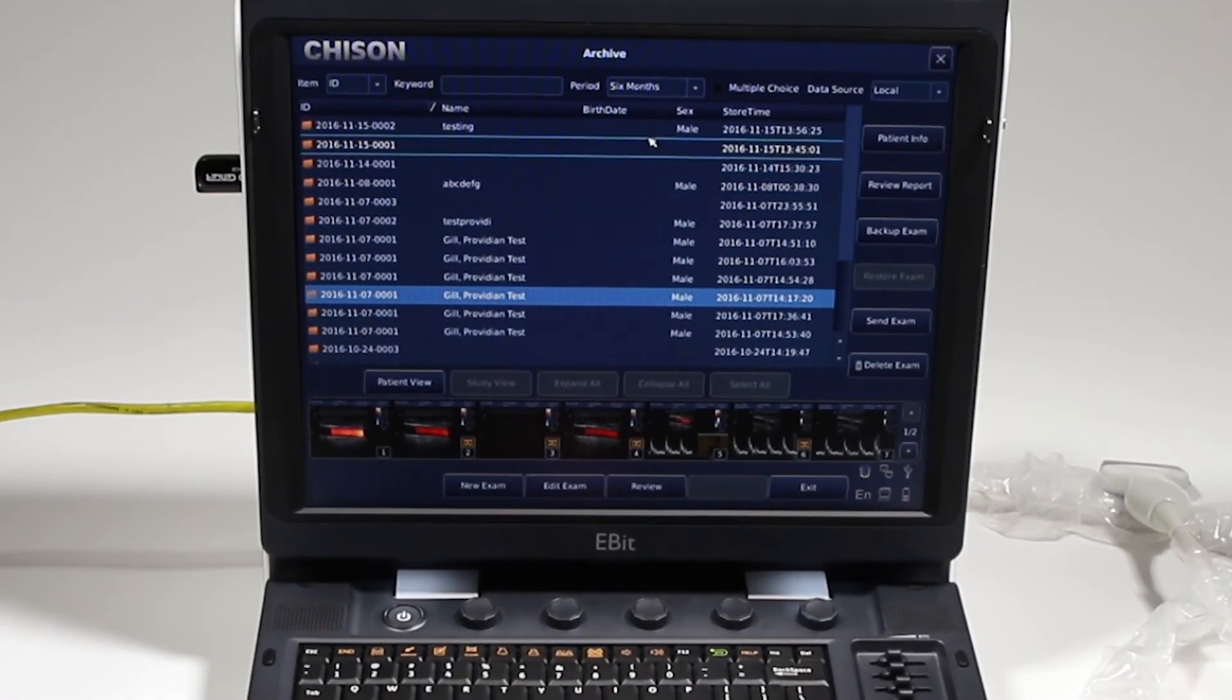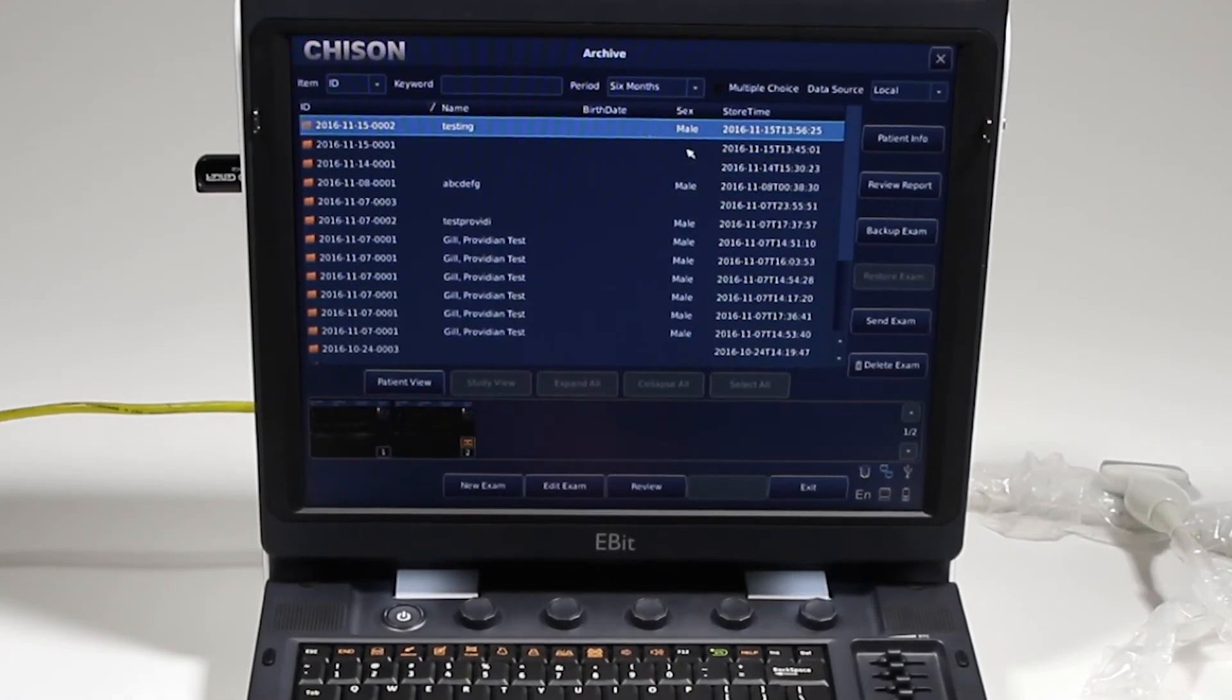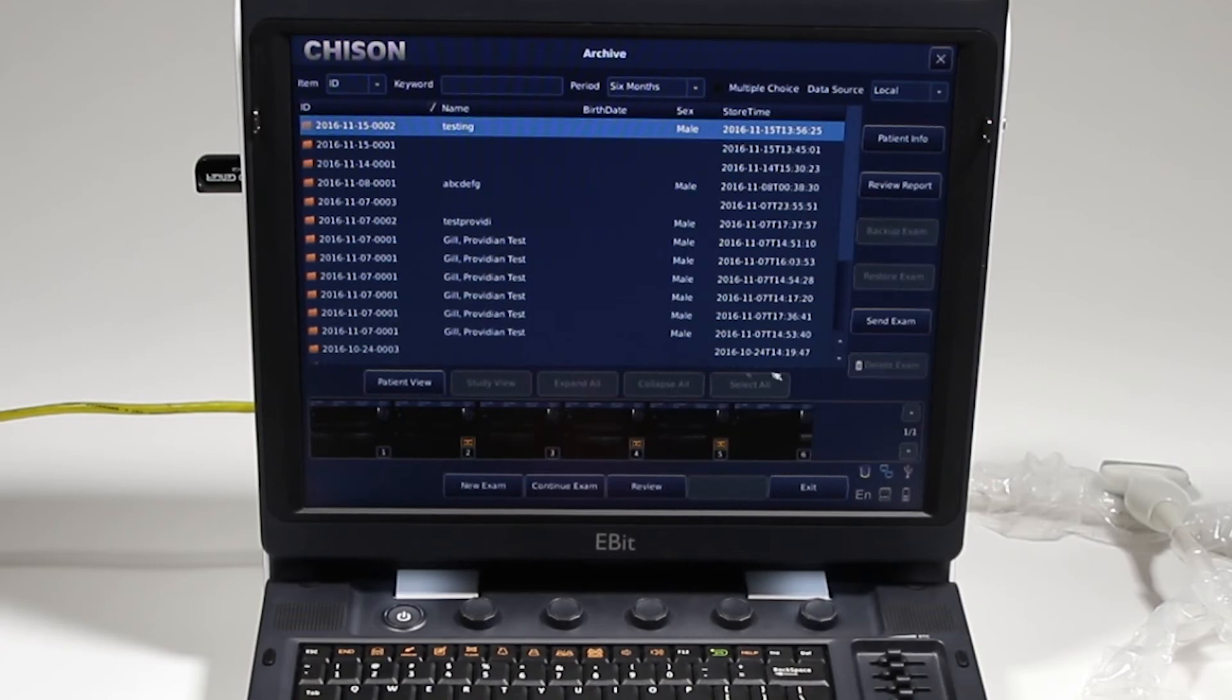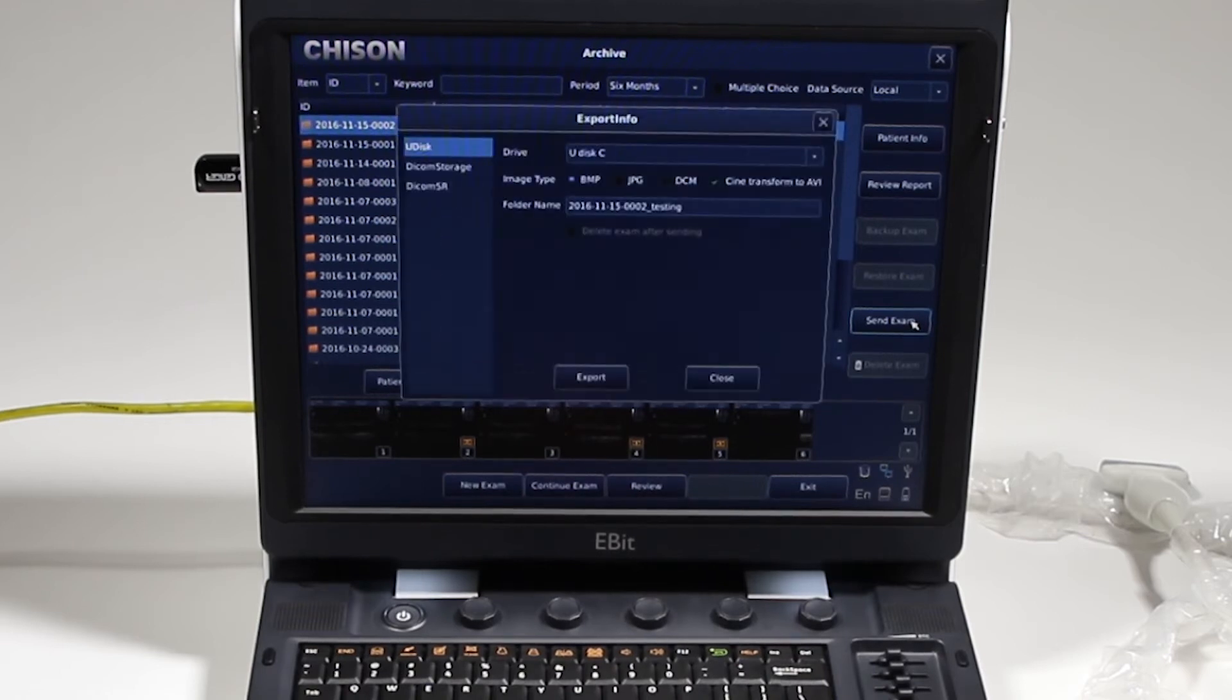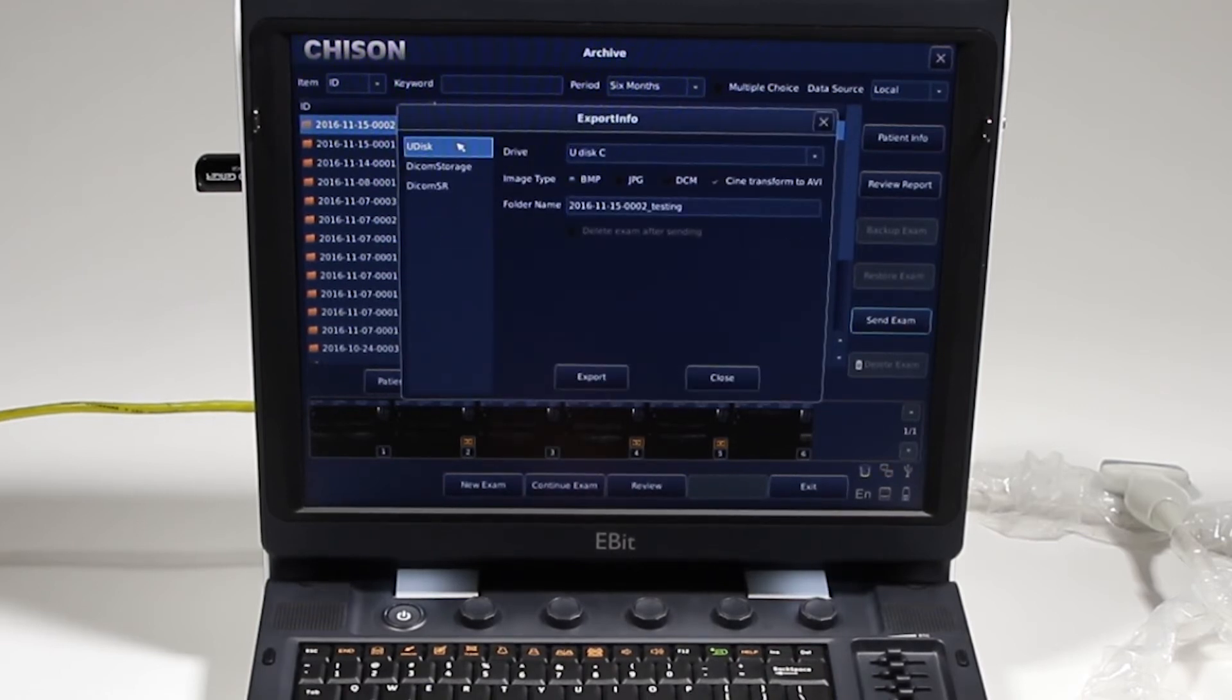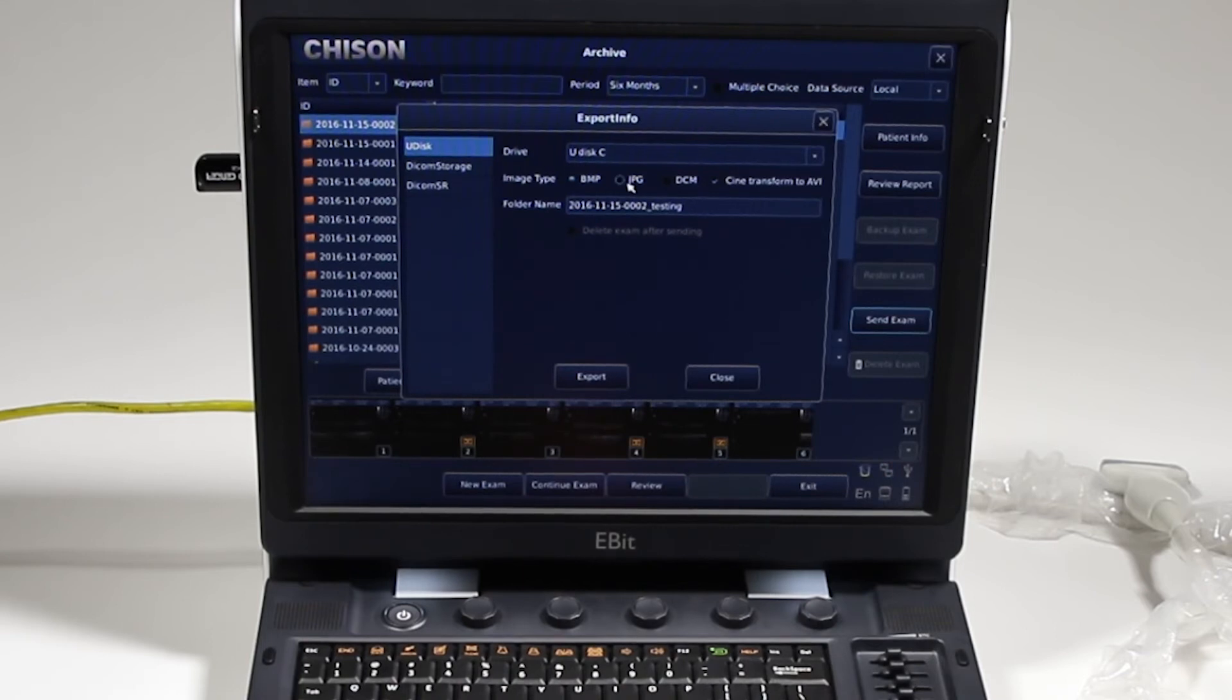I'm going to choose this current patient, the one that I'm doing here, and I'm going to go ahead and click. Well, first, I can review the report, but I'm going to click send exam. It's going to give me a couple options here. Udisk for that USB stick, and I'll do that first.